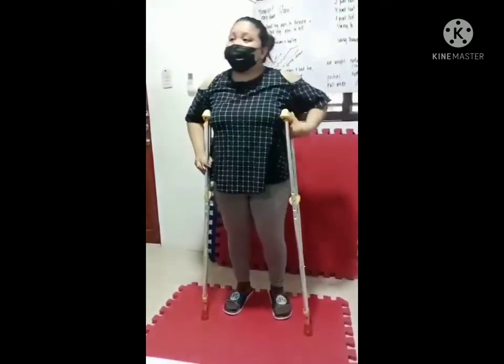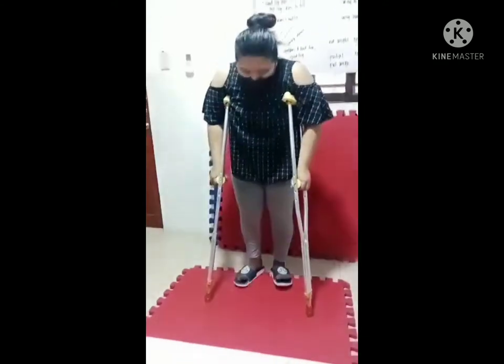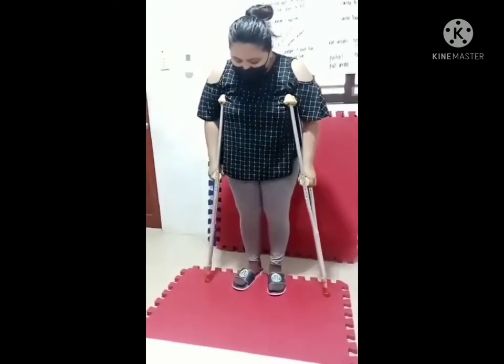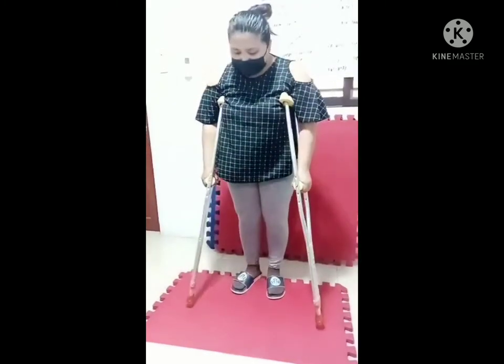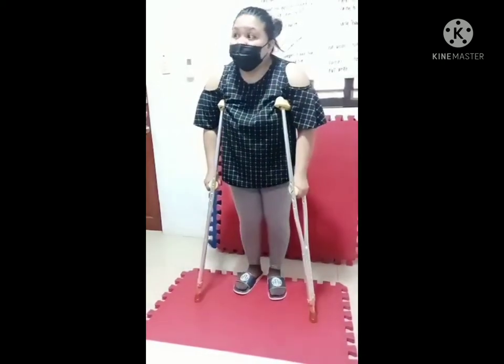We need to assist the patient into a tripod position, placing the crutches at a 45 degree angle, 6 inches to the side, and 6 inches forward. The focus of the weight should be on the hand grip.